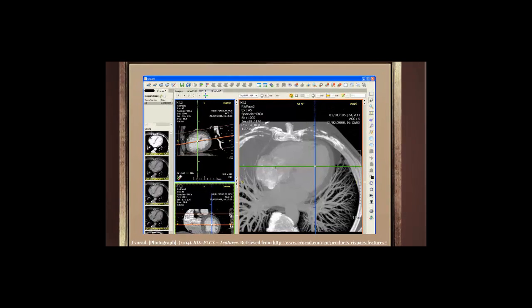You log into that software and you can see anybody's images, whatever they've had done, and it's a lot easier. The images are actually more detailed with the invention of CR, computed radiography, and now DR, digital radiography. You see a whole lot more than you ever could with film. So the benefits are just huge. You can get reports back to the doctor a lot quicker because, like I said, I've worked at some places where at nighttime the radiologists are working at home. The monitors are a lot more expensive because they're looking at so much detail.